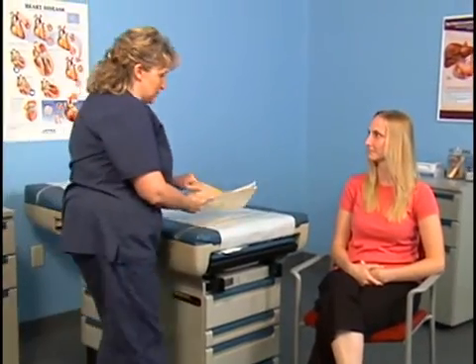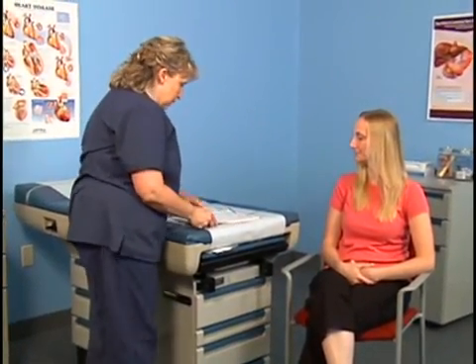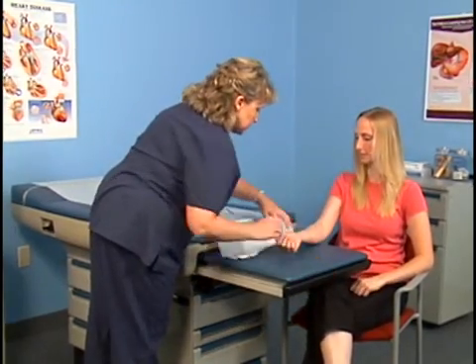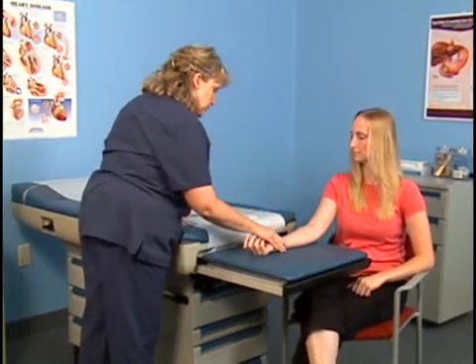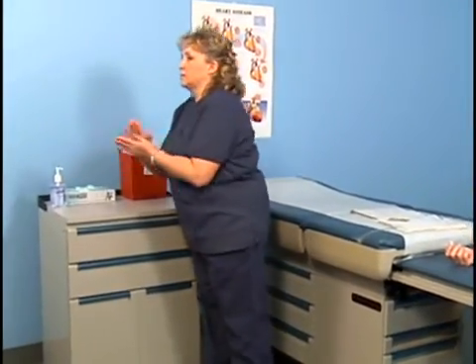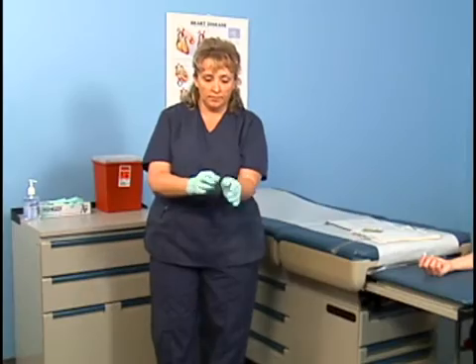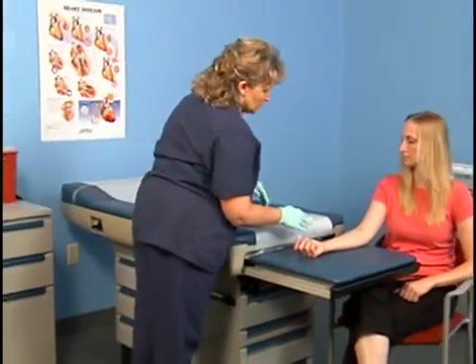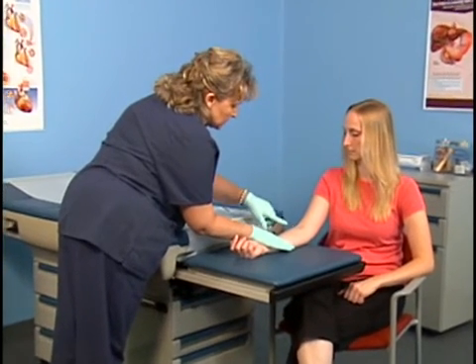Greet the patient and introduce yourself. Identify the patient and explain the procedure. Work in a quiet, well-lit environment. Check the patient's chart to determine which arm was used to administer the test. Sanitize your hands and apply gloves. Have the patient flex the arm at the elbow.